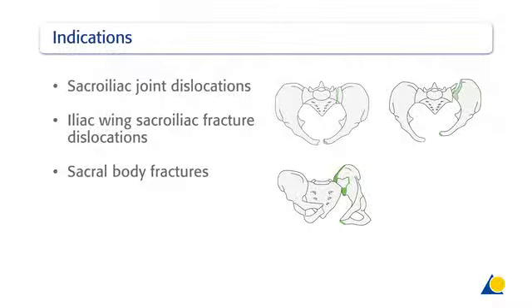The indications are sacroiliac joint dislocations, iliac wing sacroiliac fracture dislocations, and sacral body fractures.